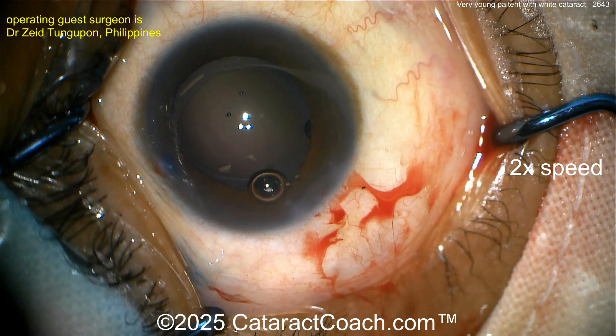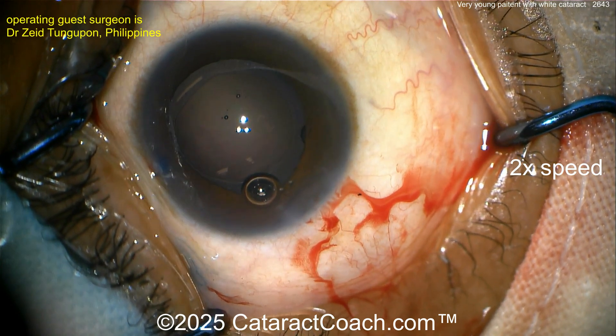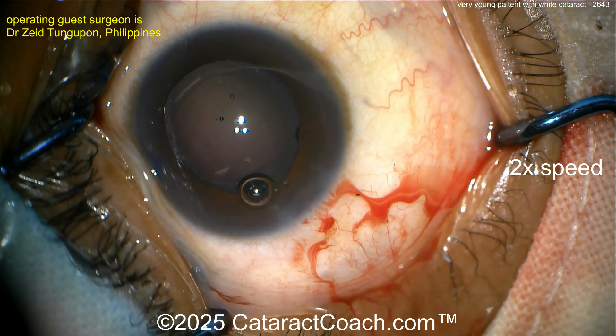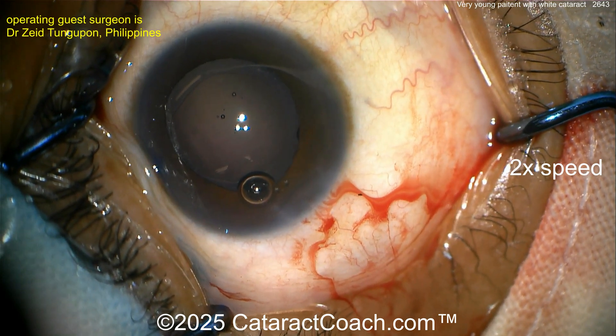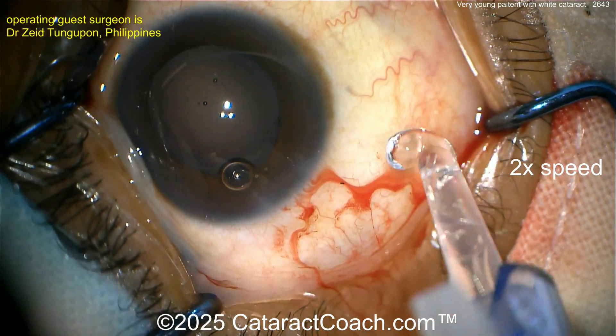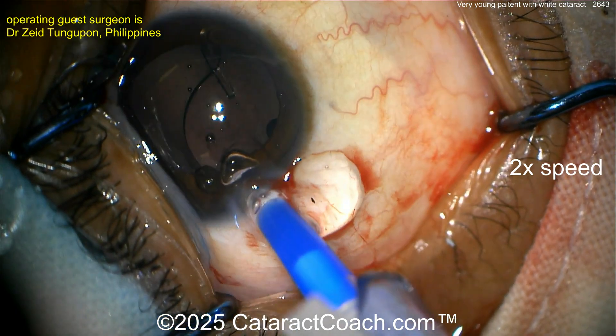Now let's see what's going on here with the lens. Sometimes it's helpful, even in this case, when you've got the eye aphakic — you don't have a lens in the eye yet — you can take a look back there. This patient may not have had a view of the retina for quite a while. And then we'll get the lens inside here. That's another question: what kind of lens do you put in a young person like this?